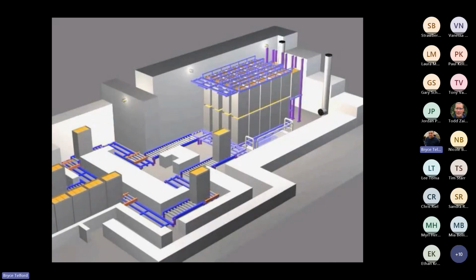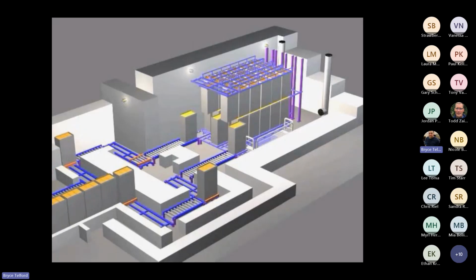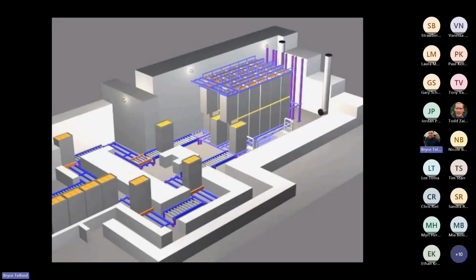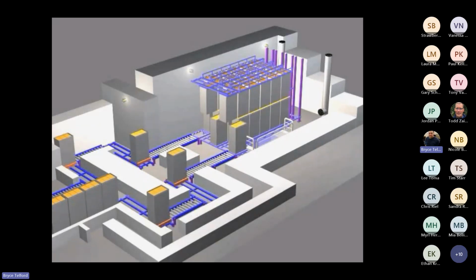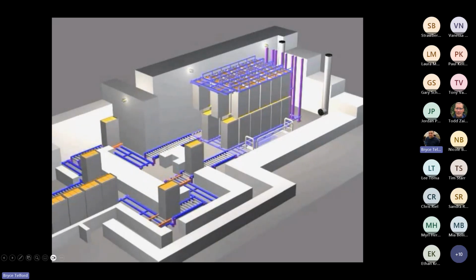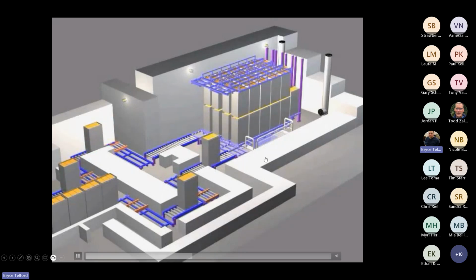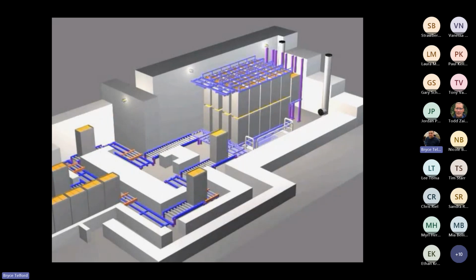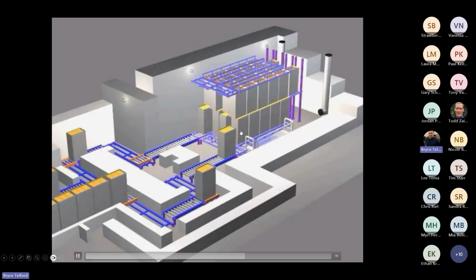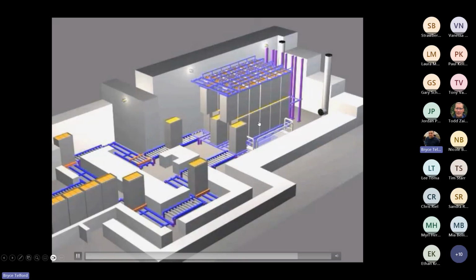As we talk about radiation, be mindful of this in the back of your head because we have dose ranges that we're going to talk about. The more dose ranges I have, the more of these cycles I can fit into. What the irradiator is going to do is group and clump their low dose products and run them together. And then they're going to group and clump together their higher dose products.